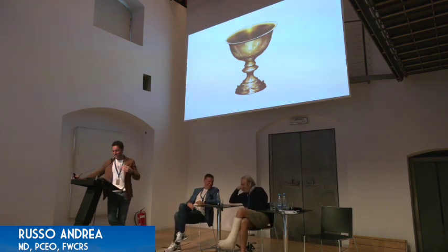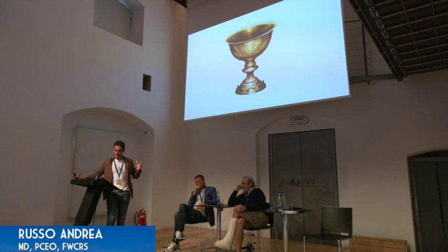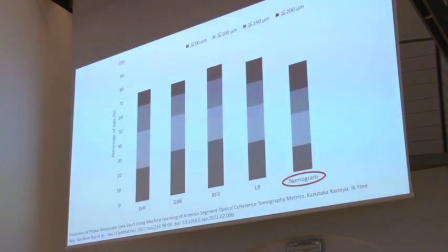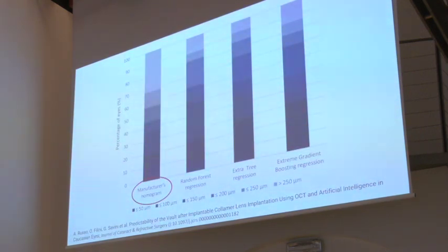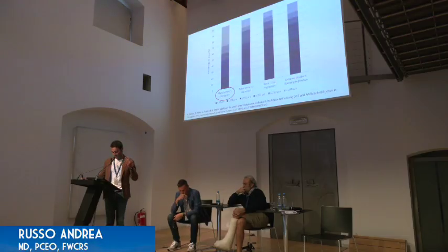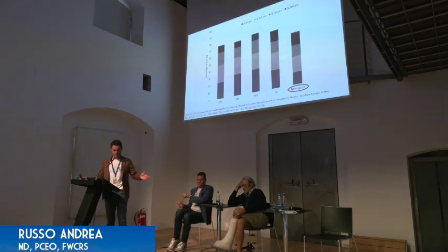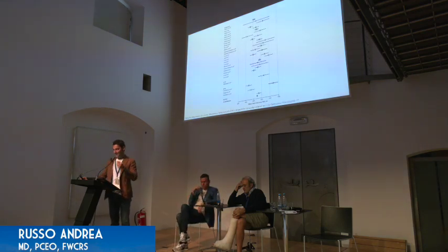However, the good news is that we came to the very same conclusion via two different studies. So I will skip these useless slides. The common points are that the OCOS formula is the least performing one, while if you use some machine learning, you can achieve way better results. It doesn't really matter if you stick to Eric's formula or our formula. So the idea is what he said.